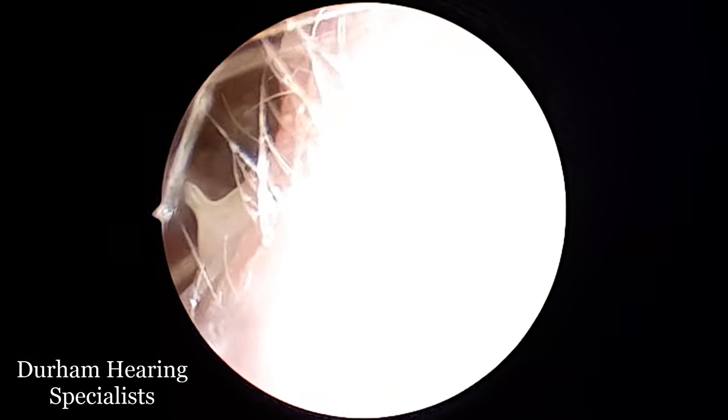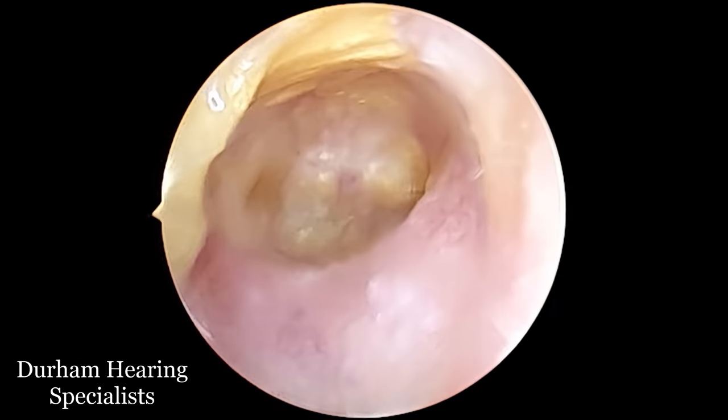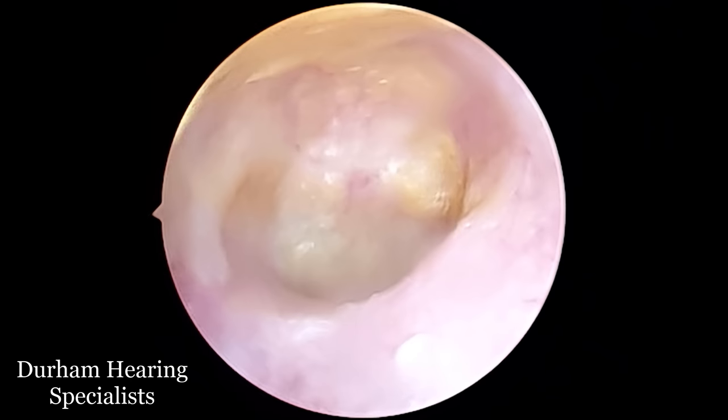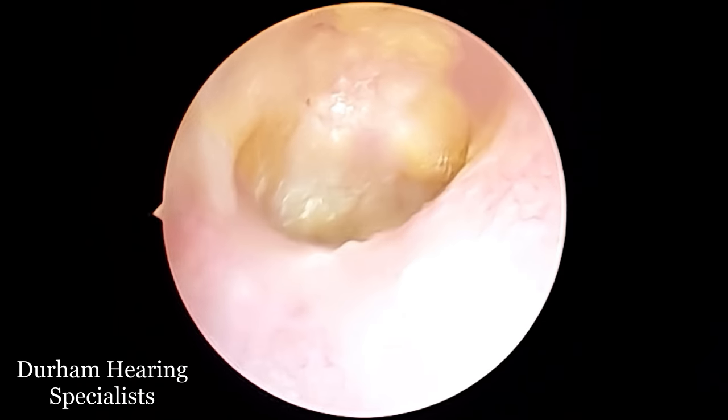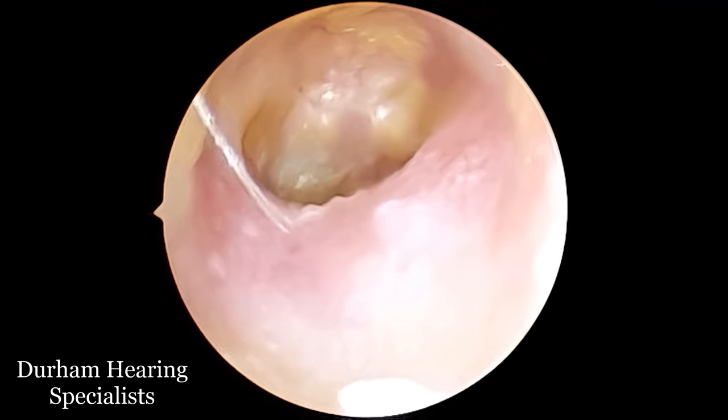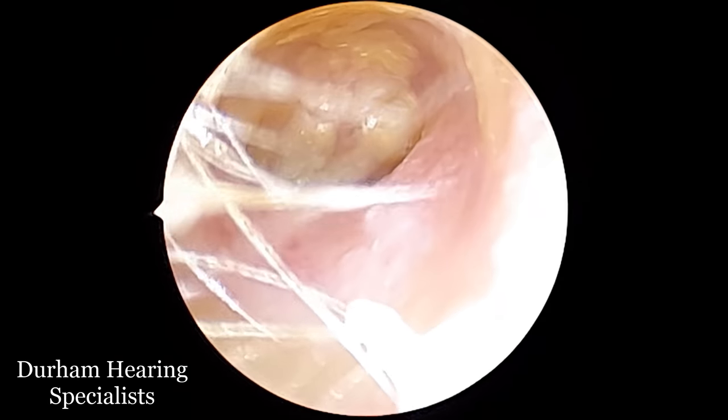Hi everyone, it's Connor here from Durham Hearing Specialists. I hope you're doing well and welcome to another video. We've got a very interesting case here. At the end of the ear canal you can see this sort of slightly bumpy, yellowish, pale debris and it's not quite clear what it is.